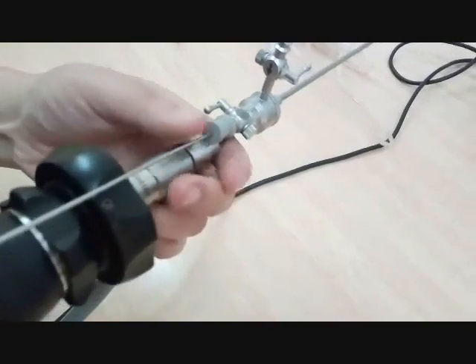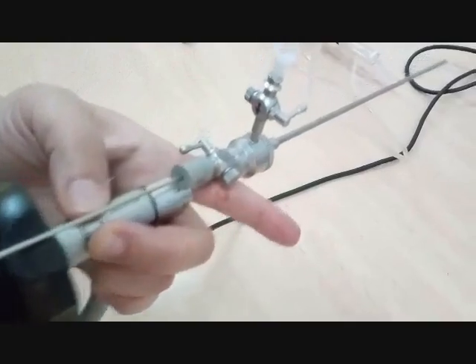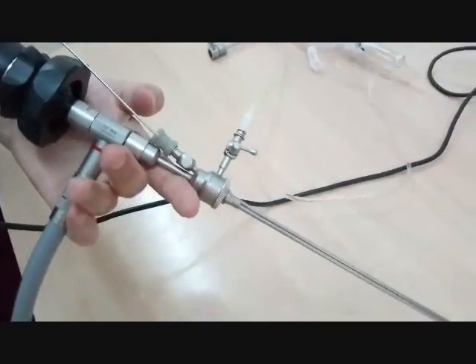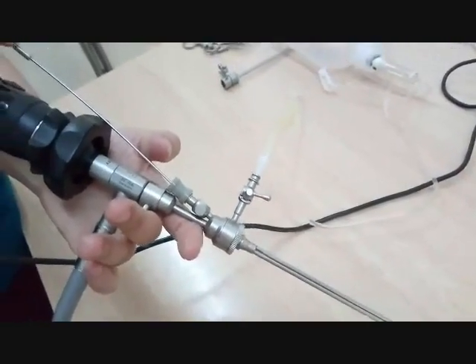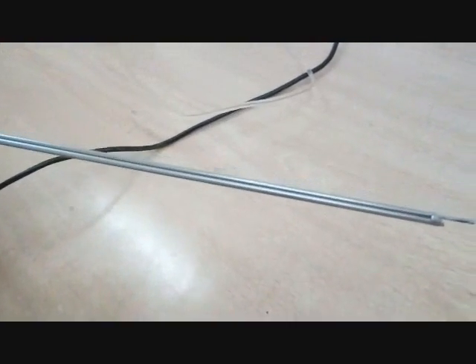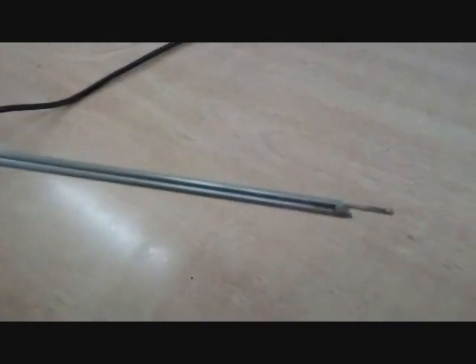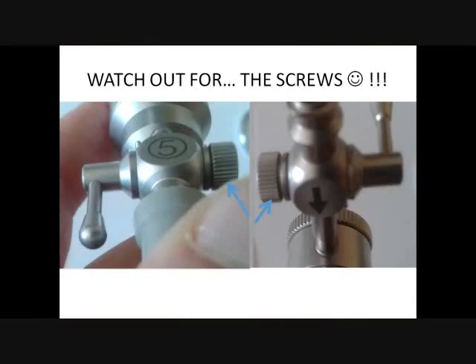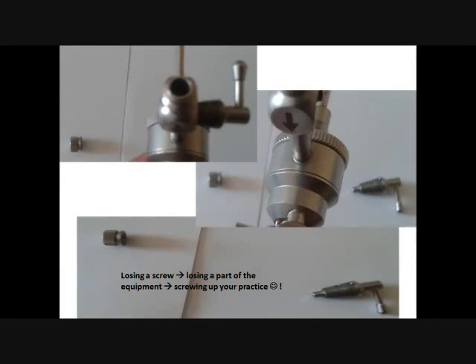We insert the instrument and we push it slowly and carefully through the working channel until we see it emerging from the other end. Just take a look with me. See? Here it is. We open and close, open and close. And very important, watch out for the screws. Because actually, if you lose a screw, you lose part of the equipment, and then you can no longer work with it. So it's very important to be careful.